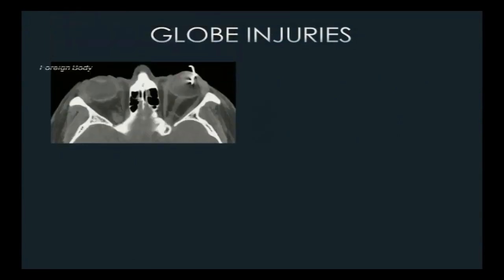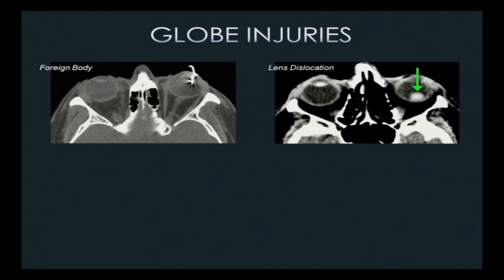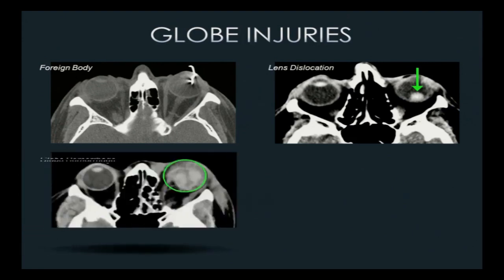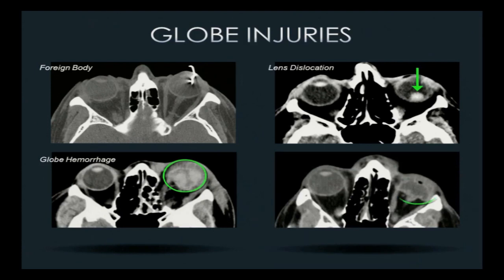Looking at soft tissues and the globe, we can identify foreign bodies — some obvious, some harder to appreciate clinically. High-energy objects can penetrate the globe with almost no telltale clinical signs, leaving a BB or metal fragment deeper in the globe. You can dislocate the lens if the zonular fibers are torn, and it will fall with gravity on a supine patient. Hemorrhage within the globe appears as high attenuation. Globe rupture has the characteristic flat tire sign or mushroom sign — intraocular pressure is slightly higher than intraorbital pressure, so vitreous humor tends to escape, collapsing the globe.